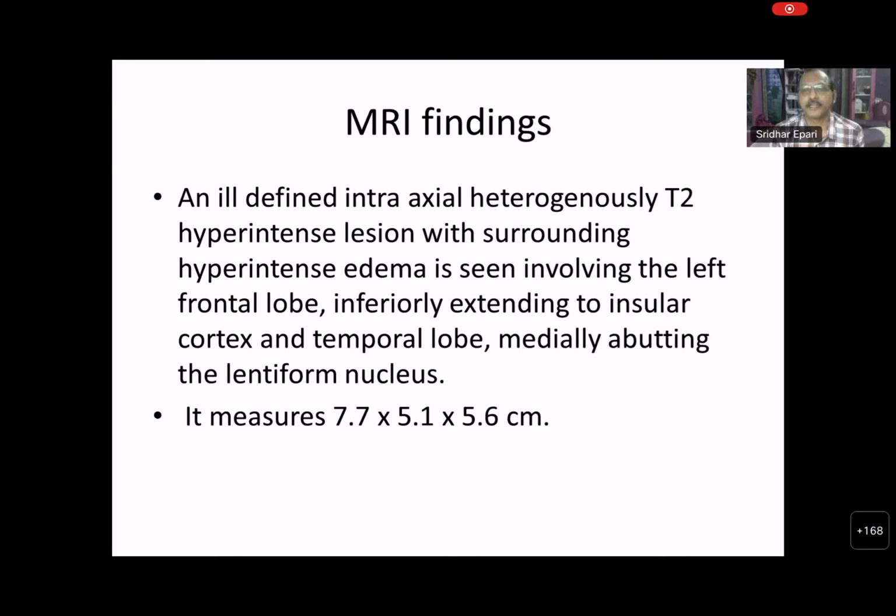Other features like a hyperintense lesion. When something is T2 hyperintense, it is produced by some kind of protein-rich fluid or mucoid matrix, something like more fluid space between the cellularity. Abhishek, do you want to add anything here? What do you look into from the history and the radiology as a pathologist? Sir, this is a young lady with a 2-year longish history, left-sided and fronto-insular. So everything looks like this is going towards IDH actually.